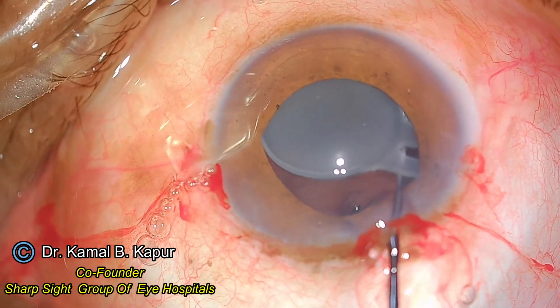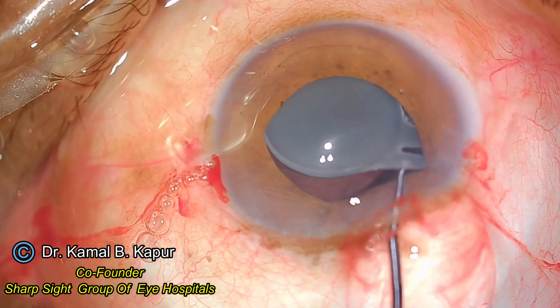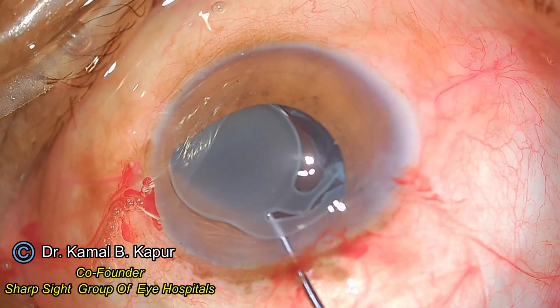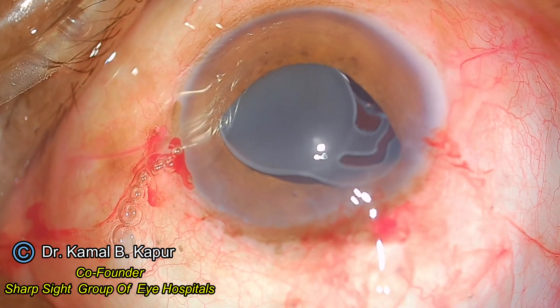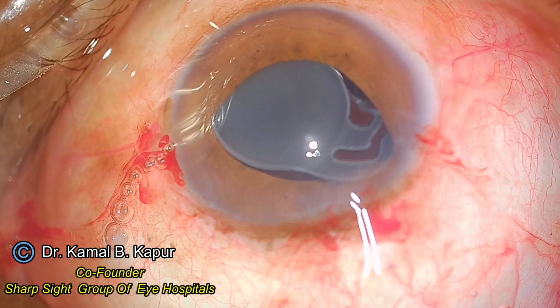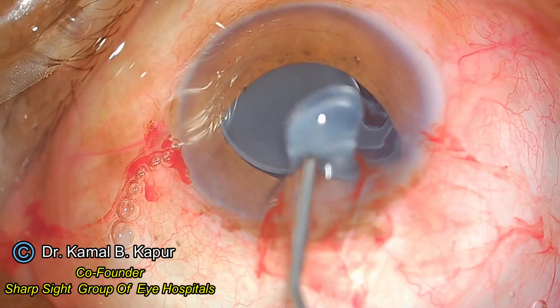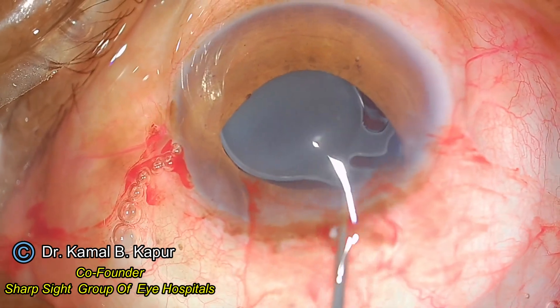I make one more attempt to pull out the IOL, but I see it is pulling the whole capsular bag with it. I decide it is probably not going to be worth it, and now is the time to demonstrate the use of the IOL cutter.